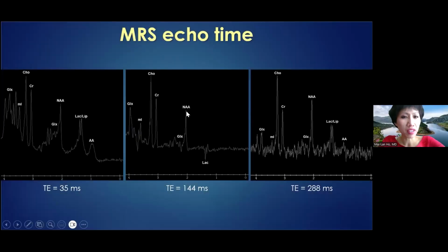Okay, and then spectroscopy. There's this saying that spectroscopy is always something for the future, right? It has a lot of potential, but it never seems to quite hit it in clinical practice. I mean, with babies, if they're moving, you have this big voxel and a small head, and then there's a lot of variation between scanners and things.